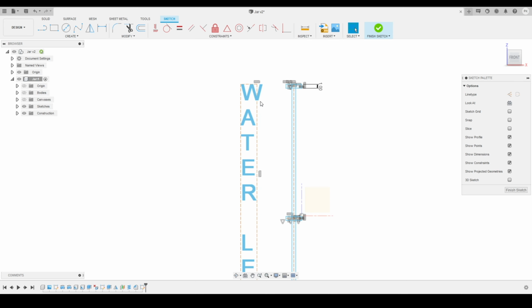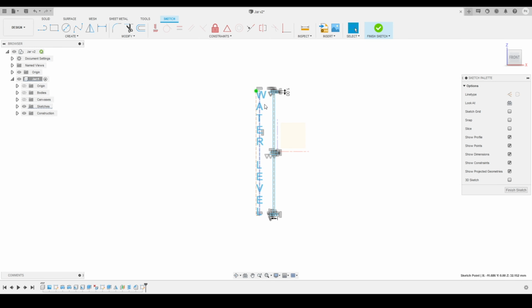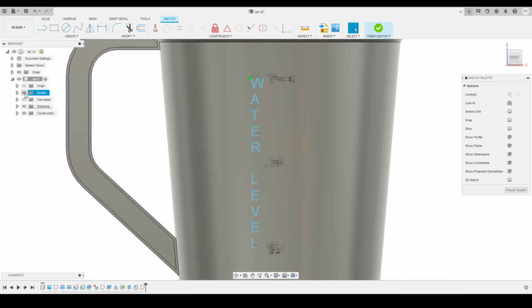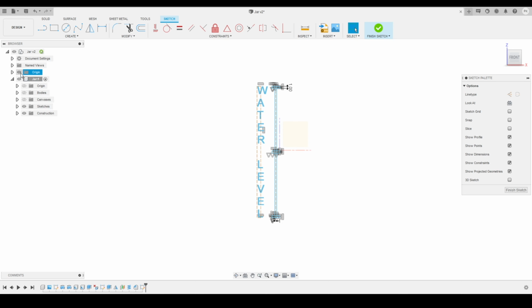So I think I had to adjust this box a little bit on the right side, and then we'll move the text a little bit closer to the markings, and this way we can adjust a few of the things. And once we are done, we can just turn on our bodies, and here you can see the position. And so before that, I will make sure that all of these things are aligned with the origin.